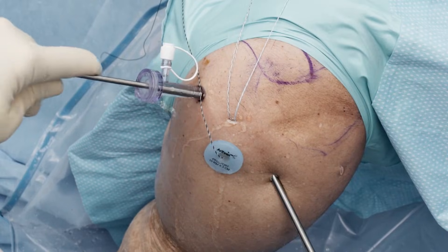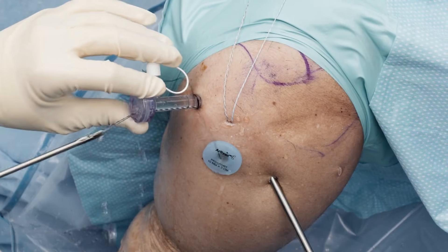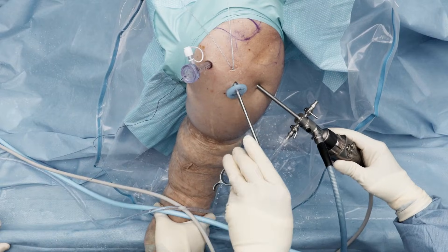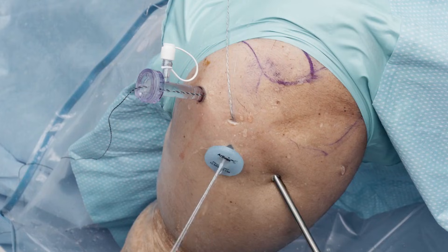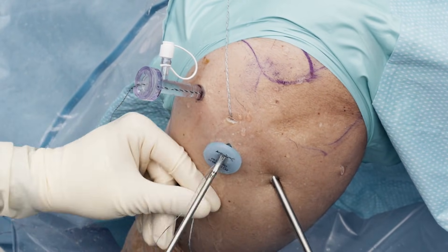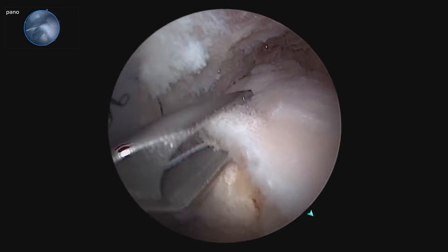So we got the first pass done. I'm going to move that out of our working portal for suture management. Now we'll retrieve our blue-white working stitch and add the second working stitch to the scorpion. We're going to hold our suture and do our second pass, making sure we stay on the correct side of all the sutures.